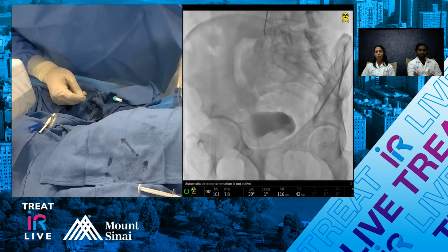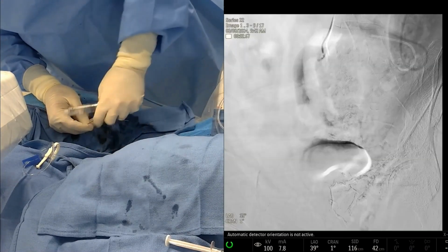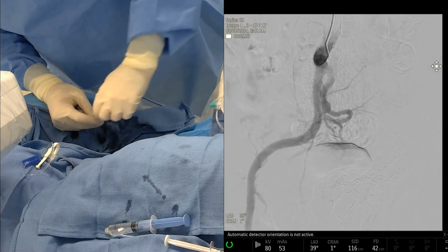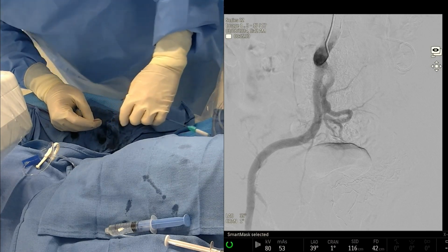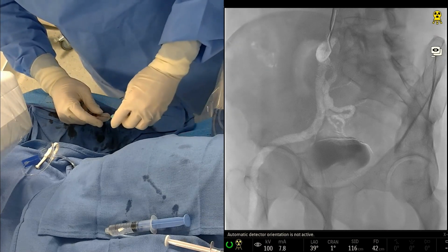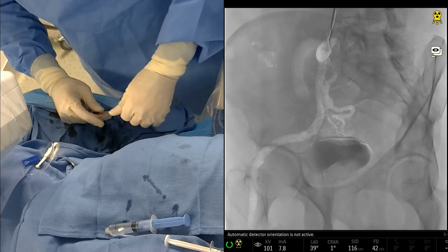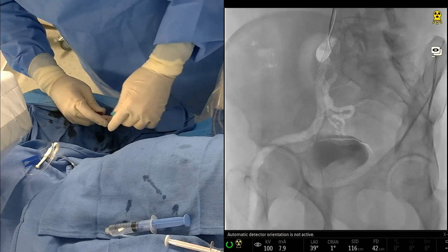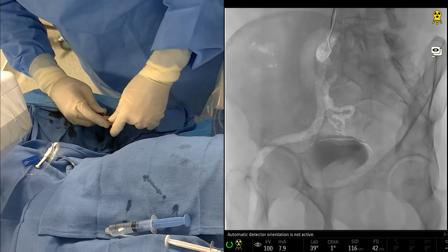Both, honestly. Let's just put up that run as a roadmap. The cases that I've done and I've repeated, and we've all done repeat PAEs. If you see these patients regularly, you realize that years later they start to get recurrent symptoms. They don't always get back to where they were at baseline, but when you bring them back and you do these angios, what's interesting is that sometimes if you just use particles, it looks like nothing was even done. That's one of the interesting things about particles: they don't really cause permanent vessel occlusion in a lot of cases. And that's not necessarily a bad thing in some vascular beds, but I think in the prostate you want a more permanent occlusion. I think it's advantageous. And so you bring them back and it almost looks like nothing was done. I've had some cases where we've coiled them and the coils haven't even occluded the vessel completely, and you see flow through the coil mass. And so there's lots of reasons why people would recur. It's probably about half and half, where it's through the main prostate versus only through collaterals.